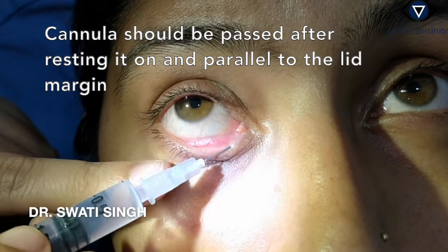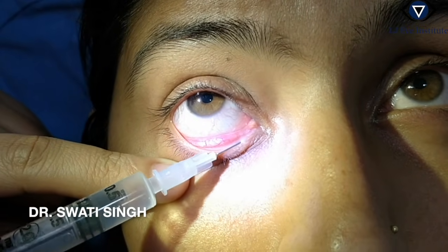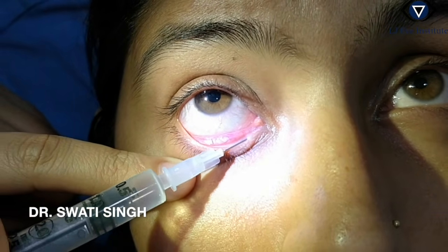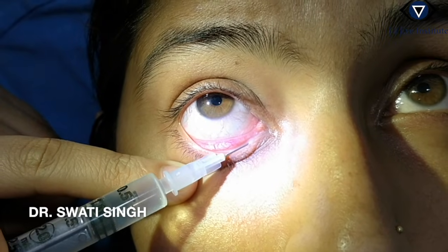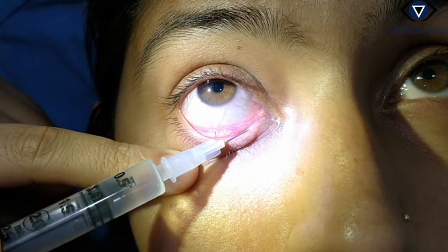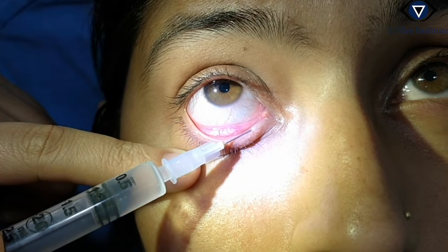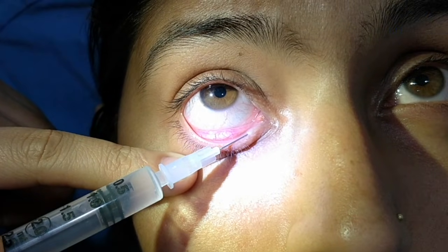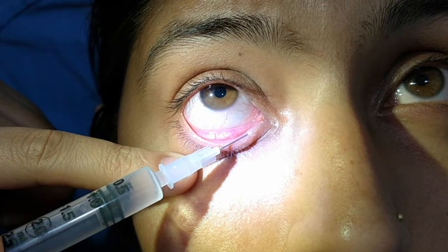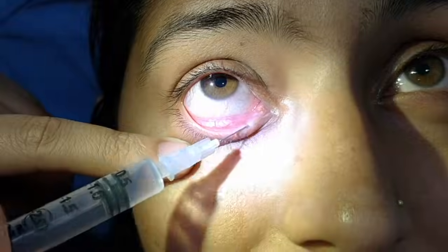Irrigate the lacrimal system with 0.5 to 1 mL of saline and ask the patient if any fluid has been felt in the throat. Try to inject slowly and in small amounts, since forceful injection can give a false regurgitation through the opposite punctum.